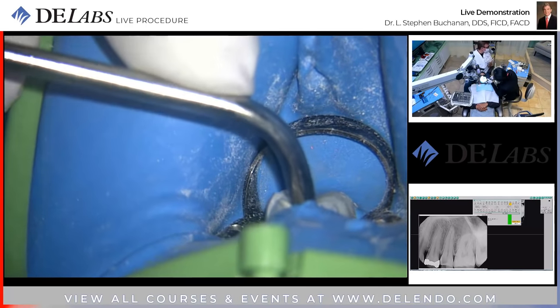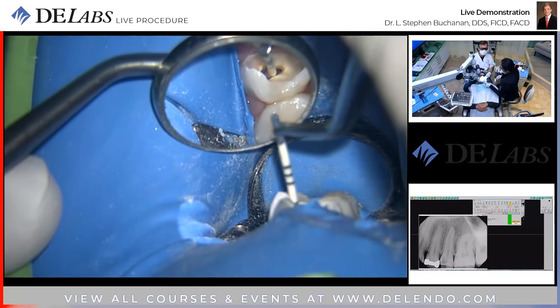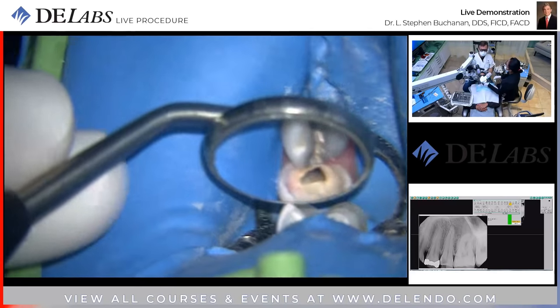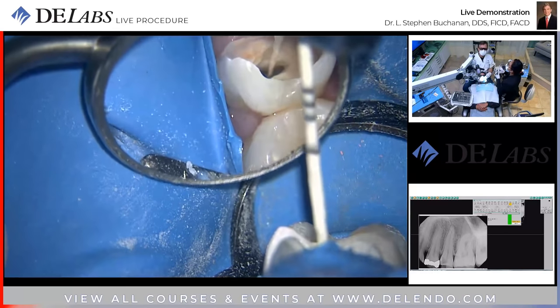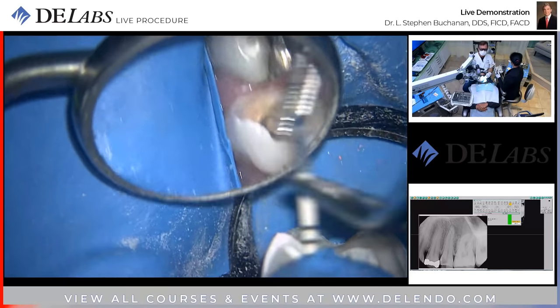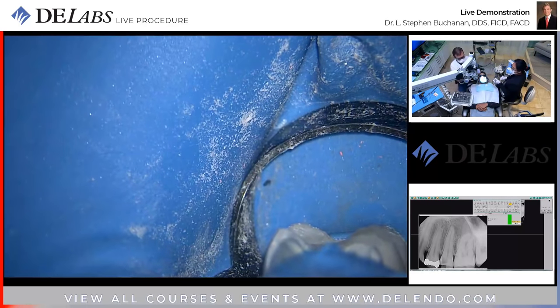Okay, so what if the apex of the tooth is lying on a dehisced sinus? The pre-op image confirmed that. So all I've got at the end of this root is soft tissue. I don't have any bony tissue. It doesn't make any difference. Remember, it's not a positive, it's a negative pressure. And the only way that a sinus affects the GentleWave negatively... and look at that big lingual fin probably going all the way down the length of the canal. Let's check it with the paper points. The part that peeks out the end is wet and bends.